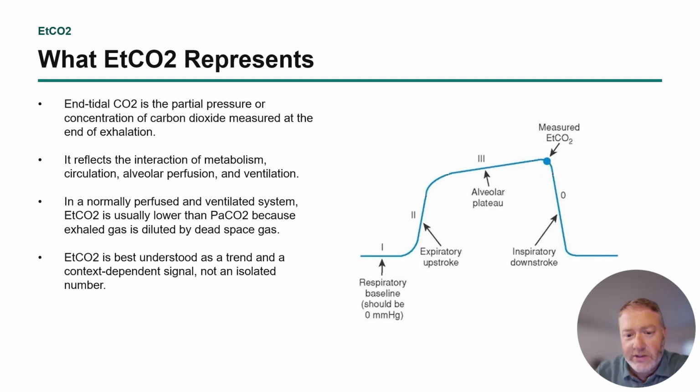And then as you exhale, and it plateaus, that piece at the tail end of exhalation is where the end tidal CO2 is actually measured.